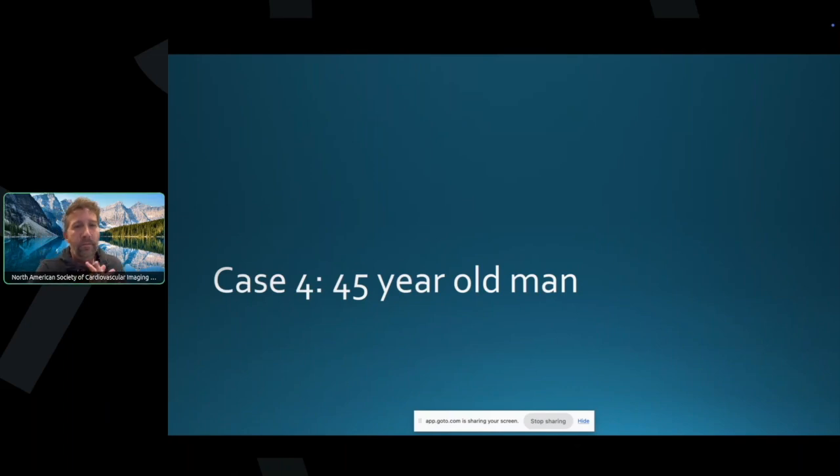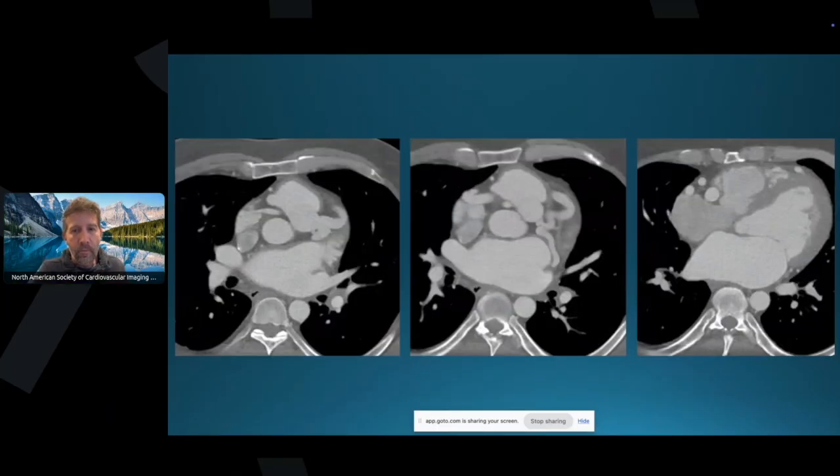Cool. This is case number 4, a 45-year-old man. I was going to do everything as a show and tell, but this one I'm going to see if anyone wants to take it from the audience.